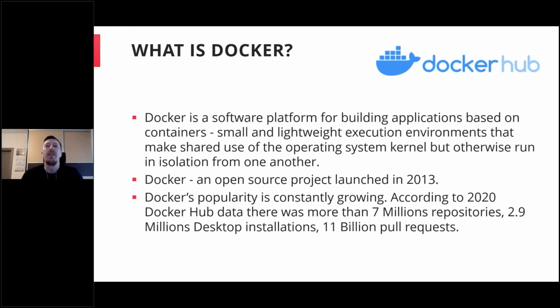So Docker is a platform which is built based on containers. They are small and lightweight execution environments that make shared use of the operating system kernel, but at the same time create isolation between them. So in principle it is similar to virtual machines. On the next slide I will show you the diagram.